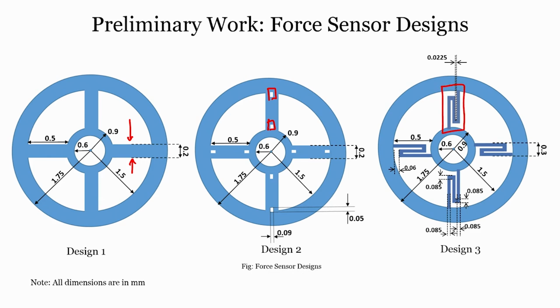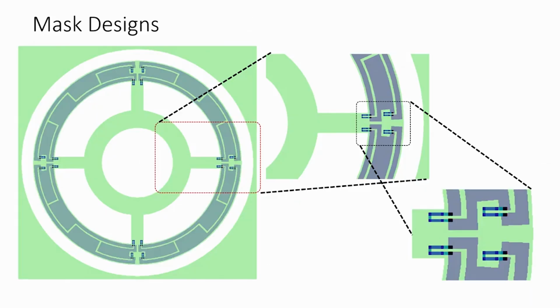sensors. Now, actually the sensor that we will be using is a diffusion based piezoresistive material, and the diffusion occurs right at the tip of this particular bridge, like this, and then there are 2 here. I will show you how exactly we have designed it, but my point is we have taken this bridge structure and then made a hole in that, and then we have used this serpentine structure just to improve the sensitivity. The dimensions are given here, which is not really important for you, but the point is, as you can see here, we have 4 strain gauges, 1, 2, 3 and 4.